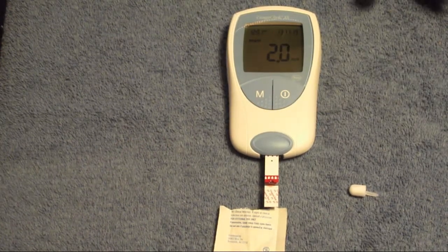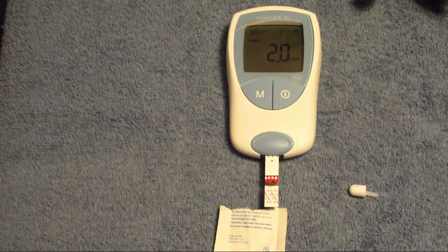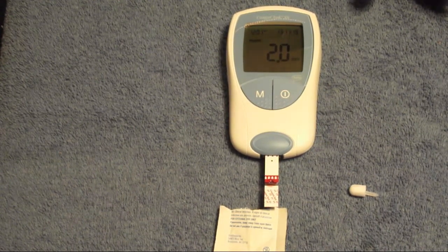Once you get your results, what you do is they give you a number to call in, and a PIN number.